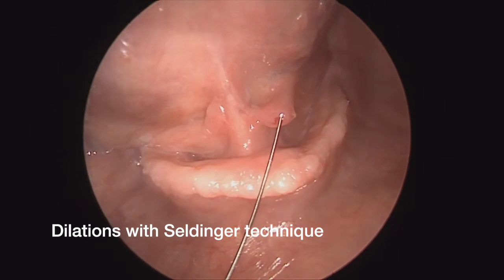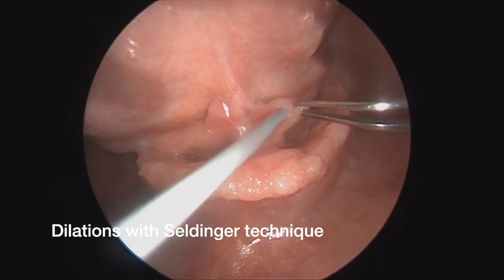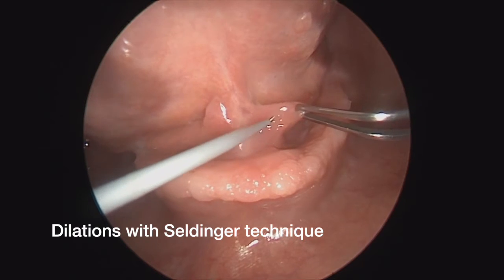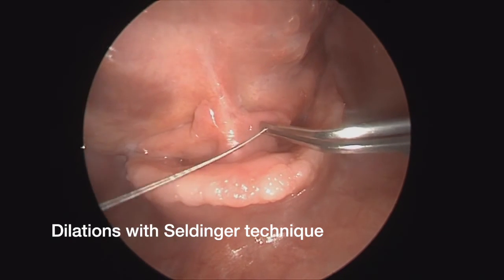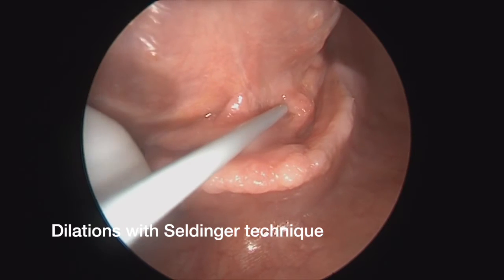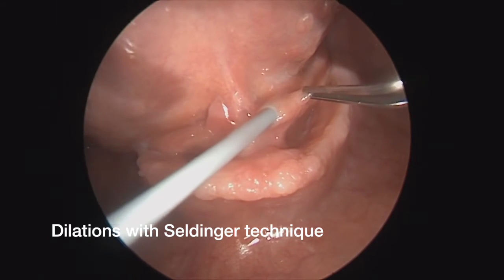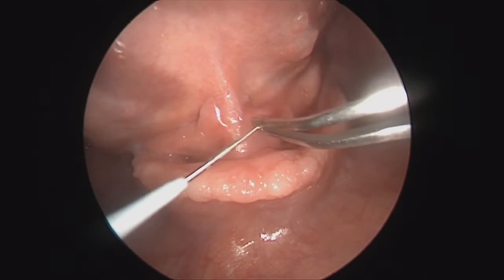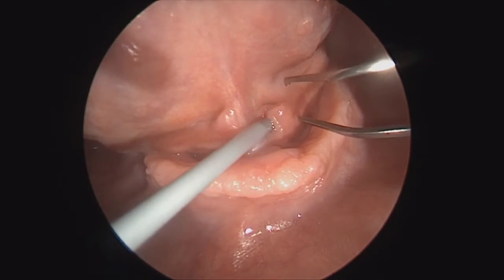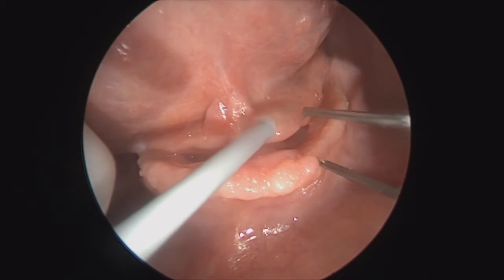This is generally in an inferior and lateral direction as seen here. At this point, once the guide wire is placed, it's relatively simple to dilate up the duct with serial dilations. These introducer kits come with disposable dilators in several sizes, increasing in diameter each time. In deciding which technique to employ, I generally follow this rule of thumb: if with loop magnification I'm able to visualize the papilla with free-flowing saliva, then I'll use the lacrimal probe dilators serially, as this will be easier to cannulate. If I'm unable to see that, particularly in patients who've had scarring or are profoundly xerostomic and don't have much saliva flow, I tend to use the guide wire technique with the Seldinger technique for dilation, as the cannulation of these ducts can be quite challenging.